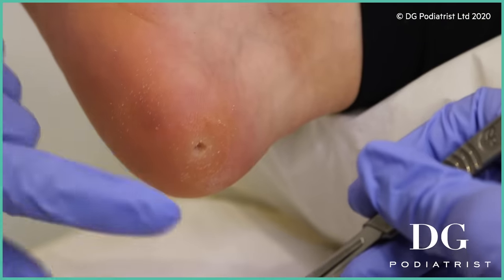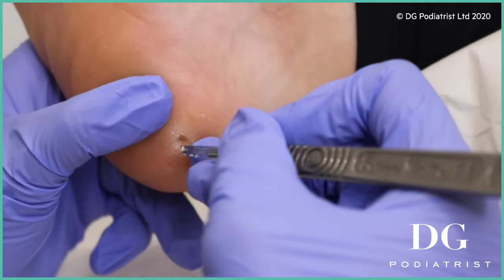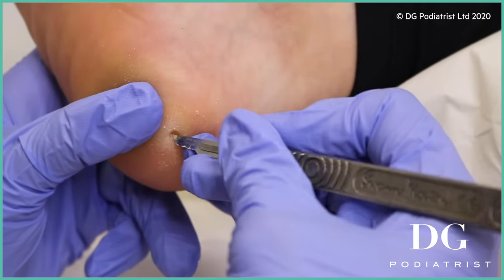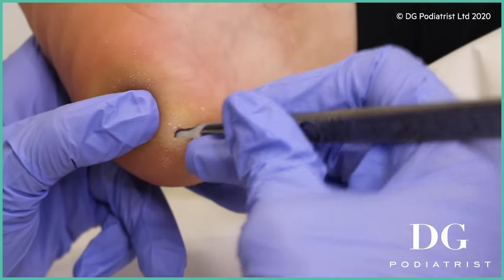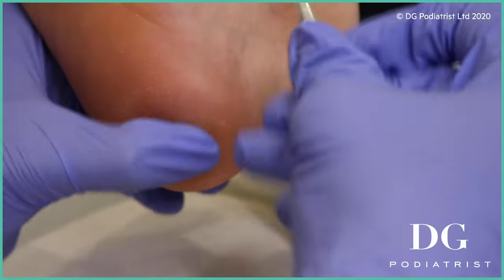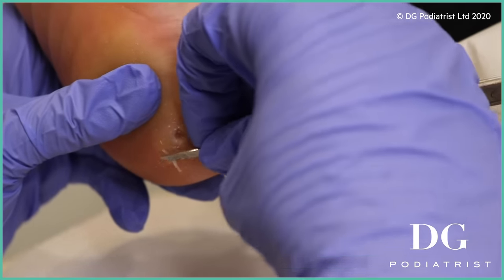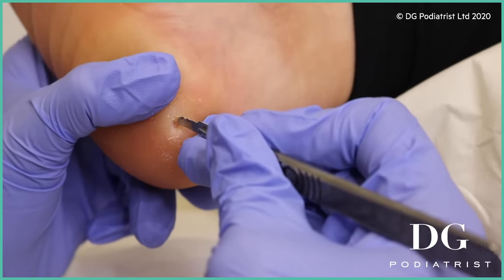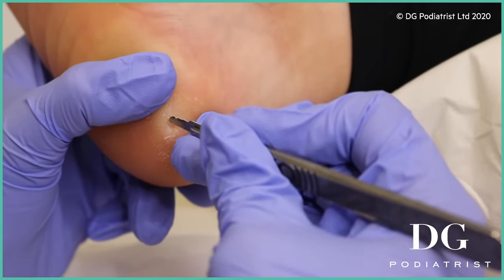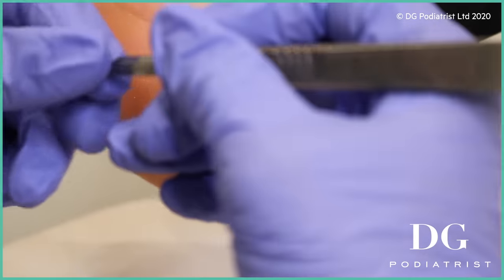So what I'm going to do is just clean the skin around that region, because even though the corn is out, you still get little areas of hard skin that sit there — that's where the corn was sitting. Now because it's been here for the last couple of months, it's been quite painful for you. I do recommend you do a salt water soak just to help relieve the soft tissue stress in the area.